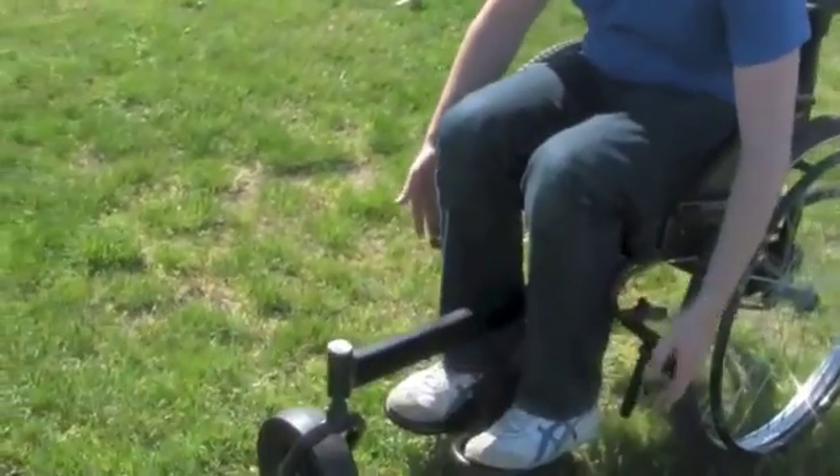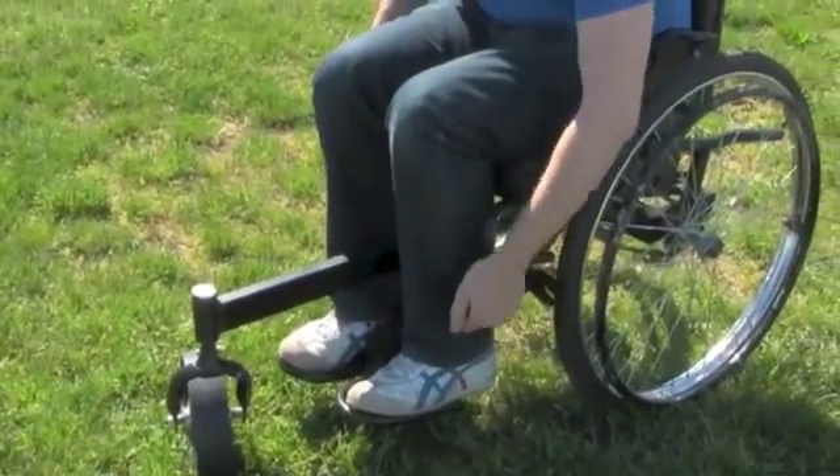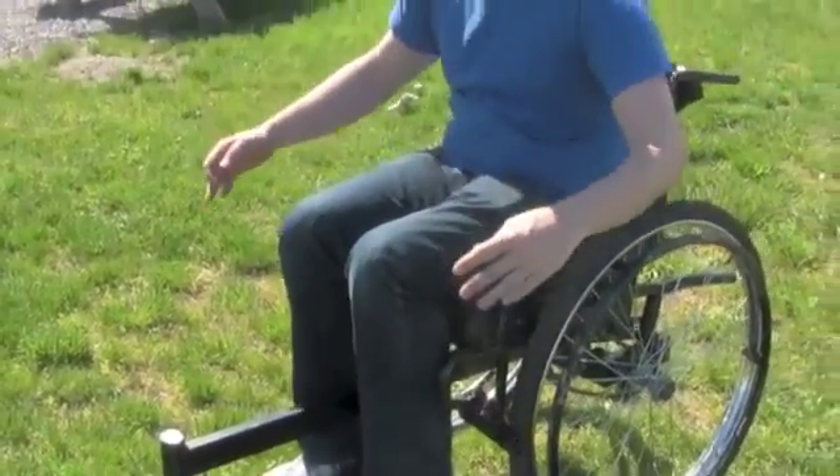Parking brakes are located on either side of the chair.